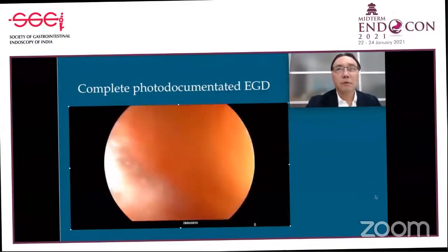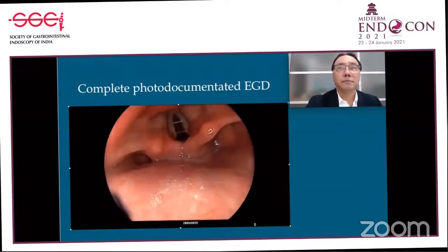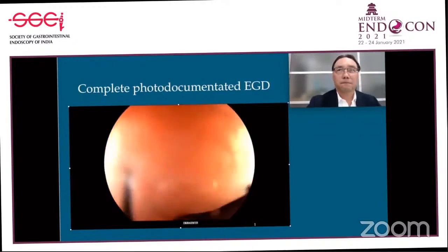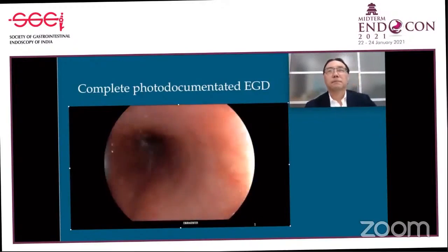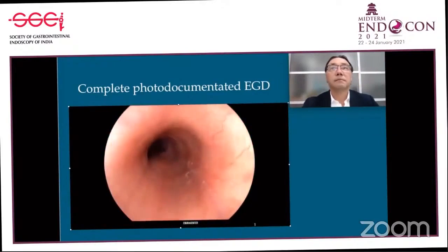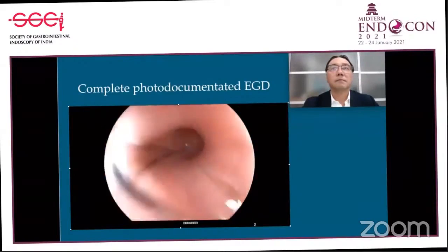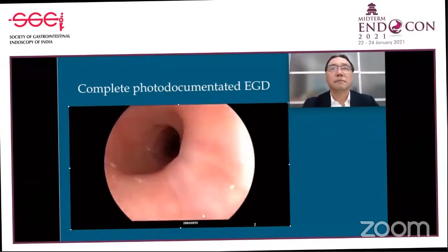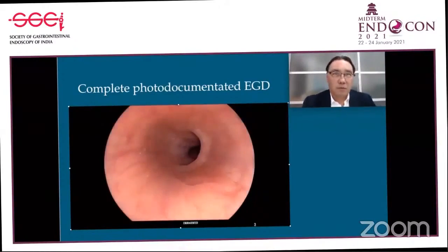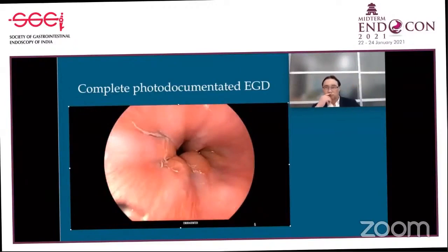This non-edited real-time complete examination of the upper GI tract starts at the hypopharynx, area number 1. The upper esophageal third is examined at natural axis, where the left main bronchus locates at the anterior wall, area number 2. Then, having the left atrium landmark as distal reference, area number 3 is captured. The distal esophageal third, area number 4, and lastly the EG junction is observed, area number 5.